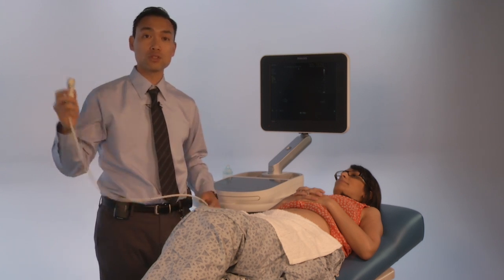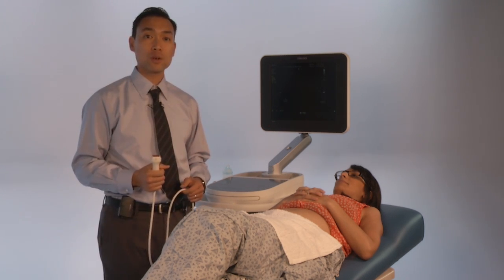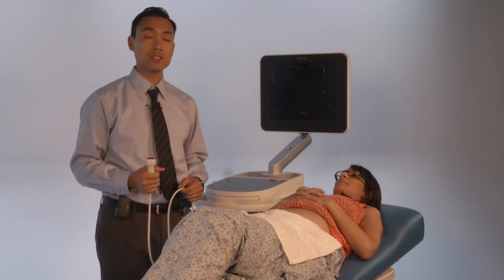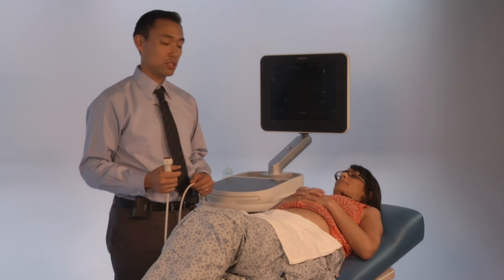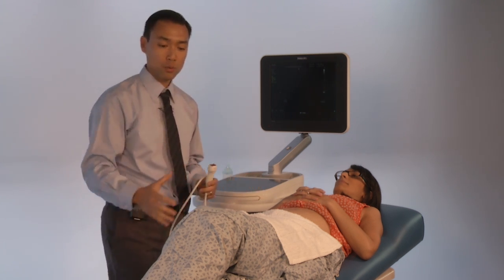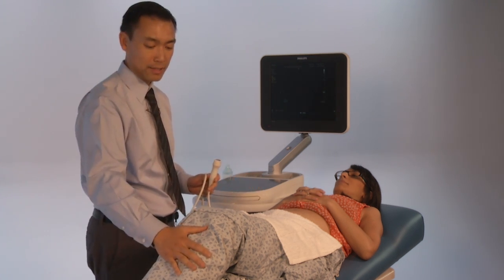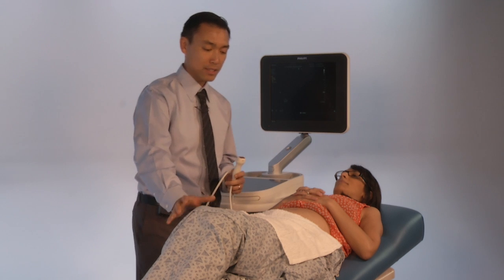We're going to be performing an obstetric ultrasound scan on a second trimester patient. For patient positioning, you want them supine with their legs elevated and flexed.